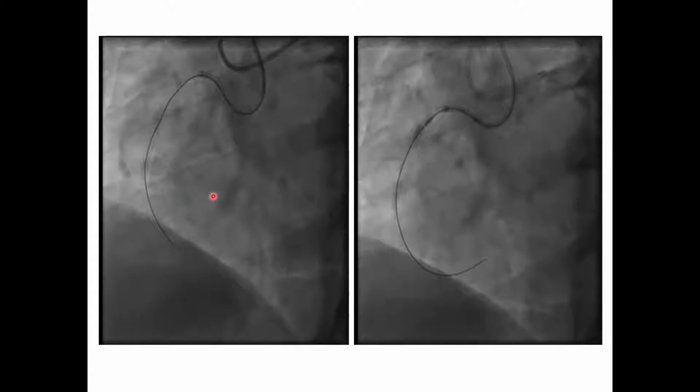Anyways, we were able to proceed and get distal to the distal cap of the CTO with a Gaia Second. However, we were subintimal. We were able to redirect it and go to the true lumen. However, we were unable to advance the microcatheter through the distal cap.